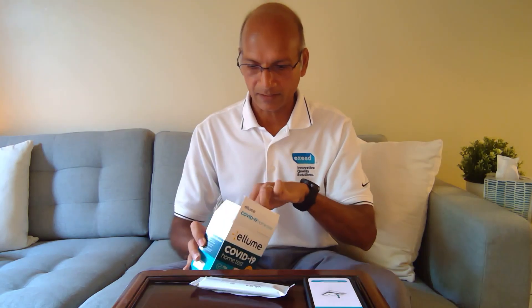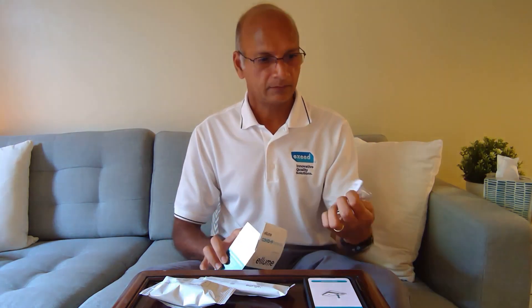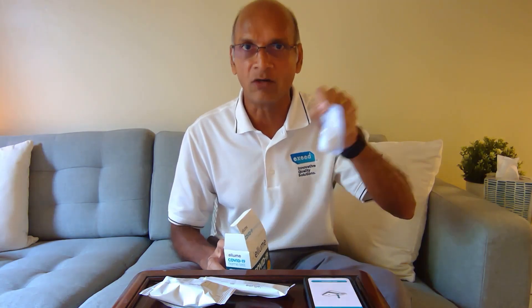We open the box and we have this package. Do not take these out before you are about to do the test. This is the analyzer — we'll set it aside. This is a dropper — we'll set this aside as well. This one is a nasal swab, very important. We don't want to touch the tip of the swab at all — no contamination. So we'll keep it like this. Do not open it.